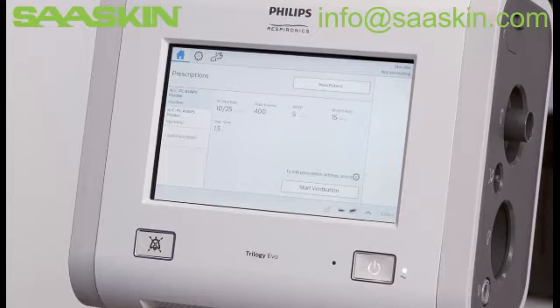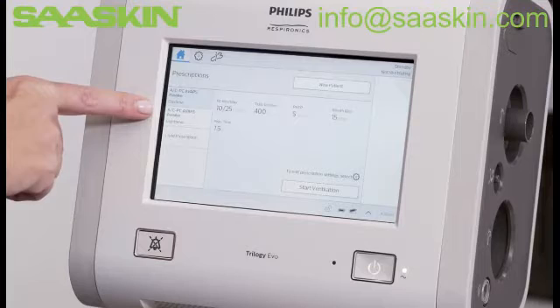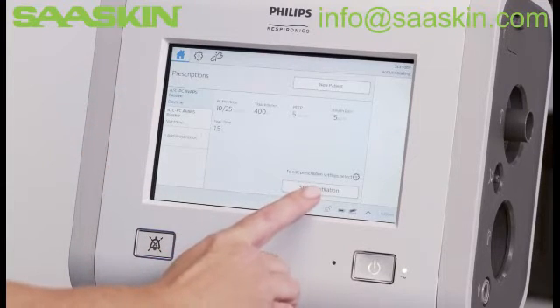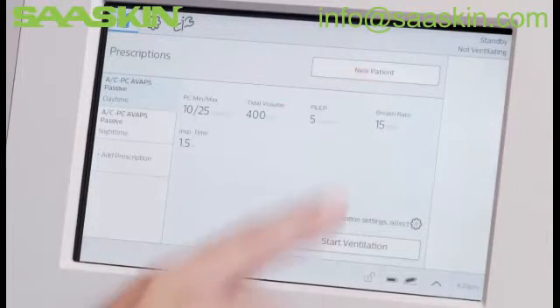While in standby on the Home window, you can view the entered prescriptions on the left-hand side. On the bottom right of the window, find Start Ventilation. The New Patient option is in the top right section.